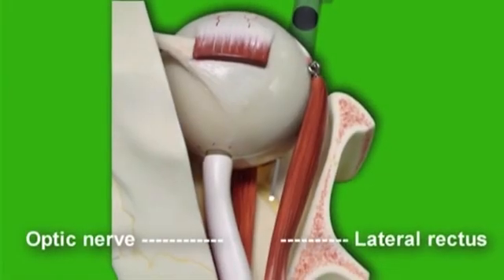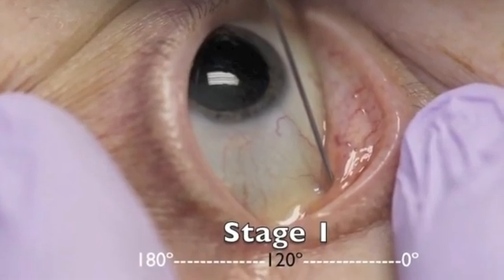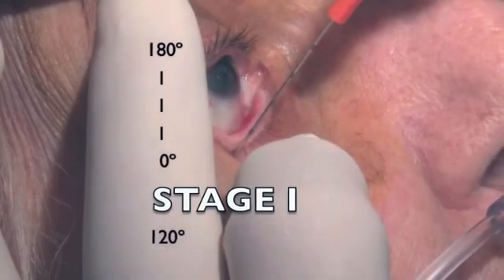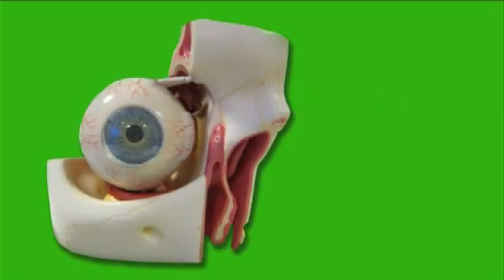We start with a 5-minute segment on the anatomy of the orbit and then finish with the clinical technique of administering the eye blocks through both transconjunctival and transcutaneous approaches. We hope this brief video will be of help in showing the anatomical principles behind administration of safe and effective peri-retrobulbar blocks. Now, we will identify the vital orbital structures as they are related to the needle tip pathway during the 3 stages of the orbital block.